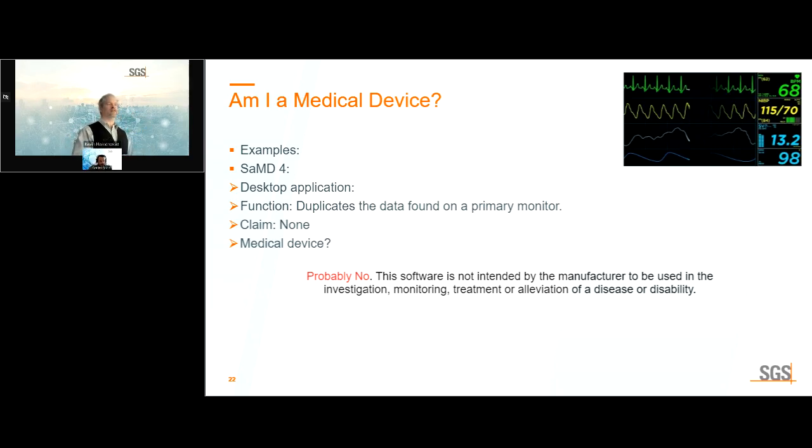So at the end of the day, let's think for a moment. If you've ever worked remotely and maybe you have an extra monitor, basic HDMI connection, and bam, it just duplicates what's on the screen next to you. This is running the actual program. This one is duplicating it. We all sort of know this. Is this a medical device that sits next to it?